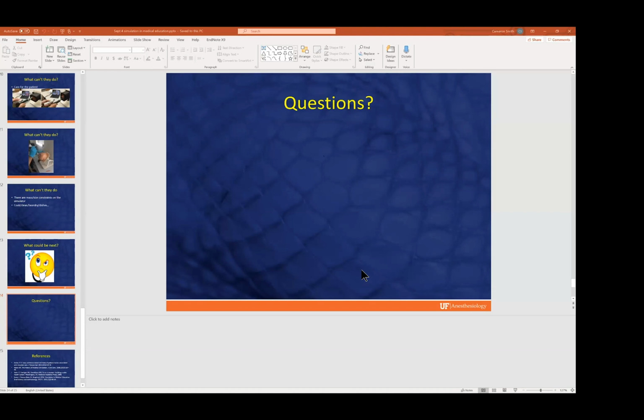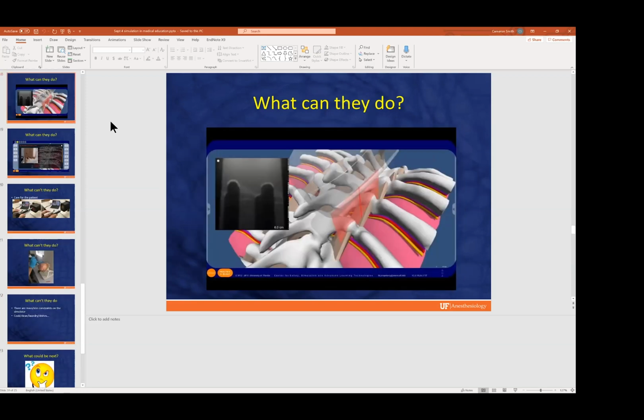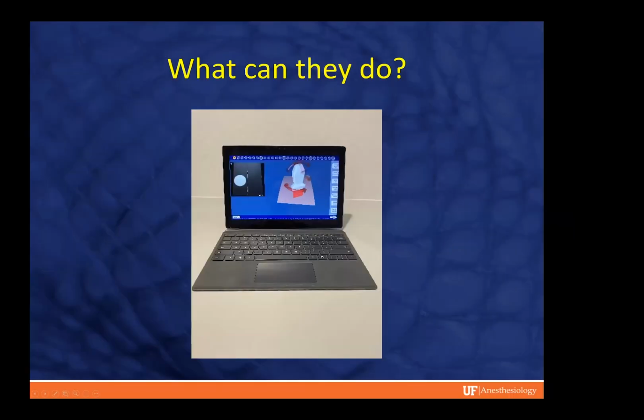I have a question. This is Sam Lampatang. Could you go over the cognitive aids that are included in the presentation? I think it's one of your slides. Yeah. So if we step back a little, this is probably the best picture, but the system is measuring the position of all of these tools in 3 dimensions, and it can tell you if something is tilted or twisted.